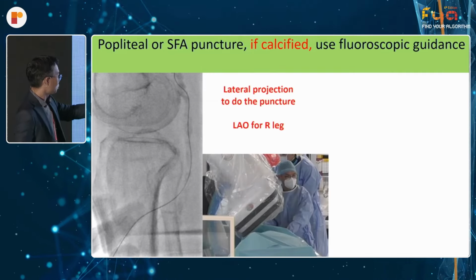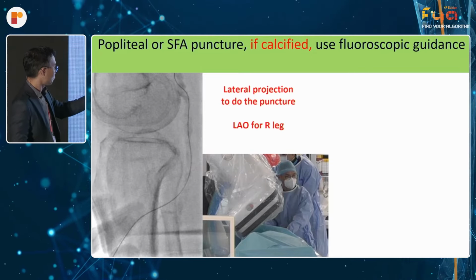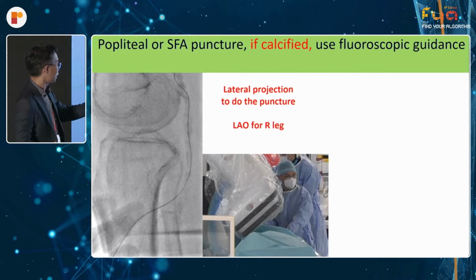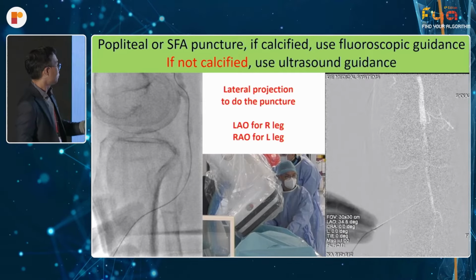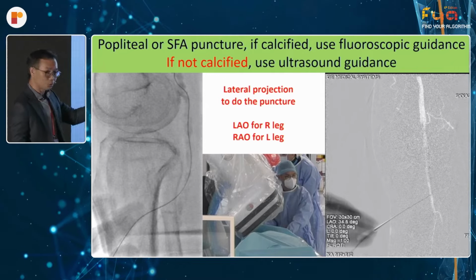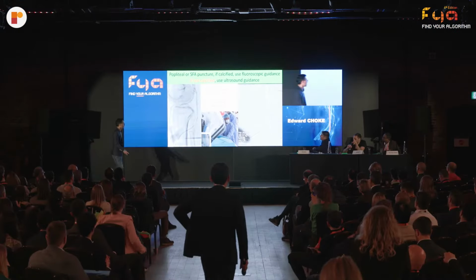In this case, I was working on the right leg. You do a lateral projection to do the puncture for the right leg. In this case, I did a LAO projection. If it's for the left leg, I'll use an RAO projection. And if it's not calcified, then the other technique is to use the overlay technique, as in this case as well.